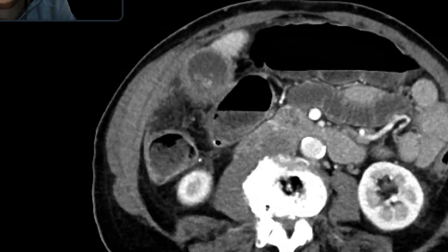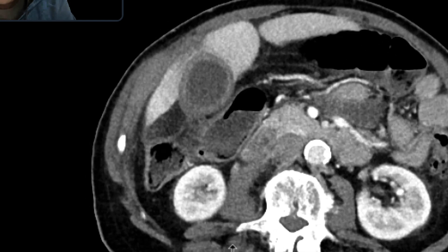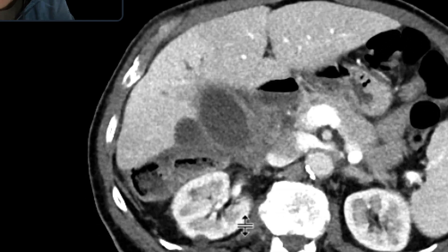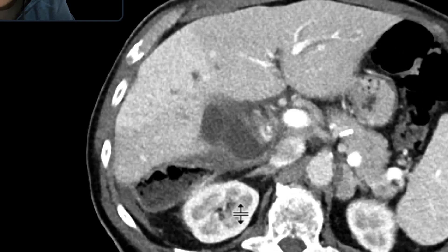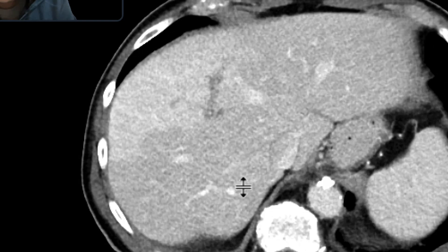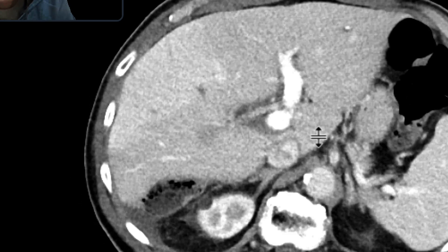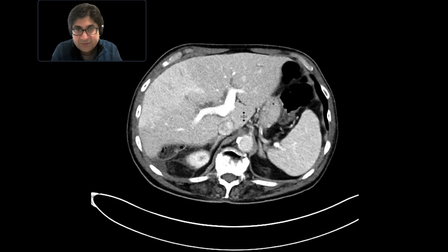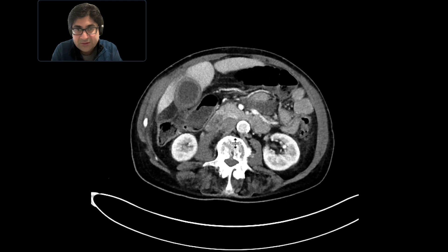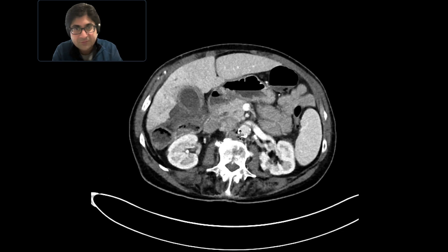Putting this all together, this is a great look for perforated cholecystitis. There is some reactive hyperemia potentially in the liver, or some of those findings may be due to thrombus in the vessels resulting in hyperperfusion in that location. This would need to be drained, which happened subsequent to interpretation of this study.